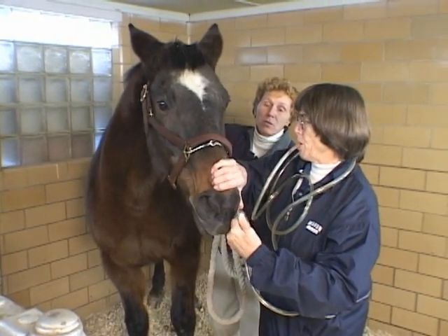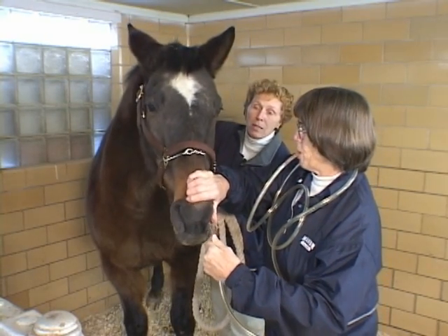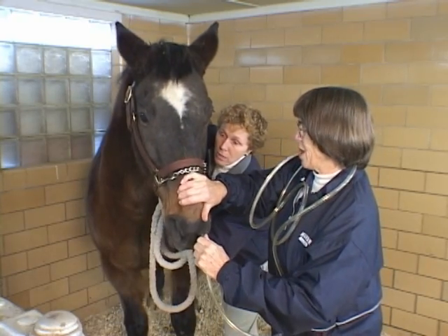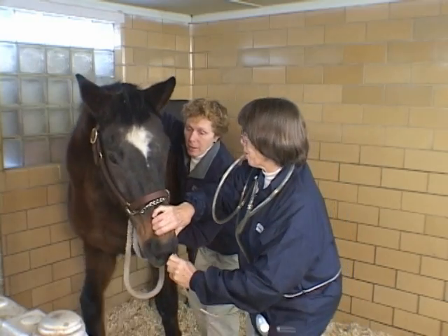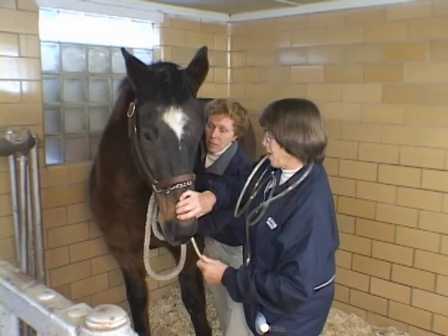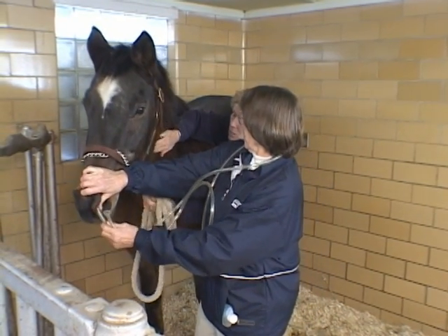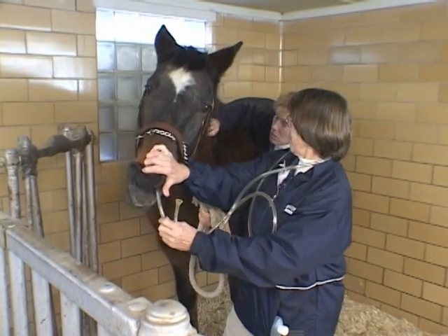We're still trying to persuade him to swallow with this tube — this is normal and we expect this as part of tubing a horse. He's being a really good guy about this, standing here but not swallowing all that well. One of the things I can do to help Dr. Hamill is by pulling his poll in a little bit and causing him to flex a little at the neck — and sometimes, yep, there you go, we're in now. Now we're in the esophagus.